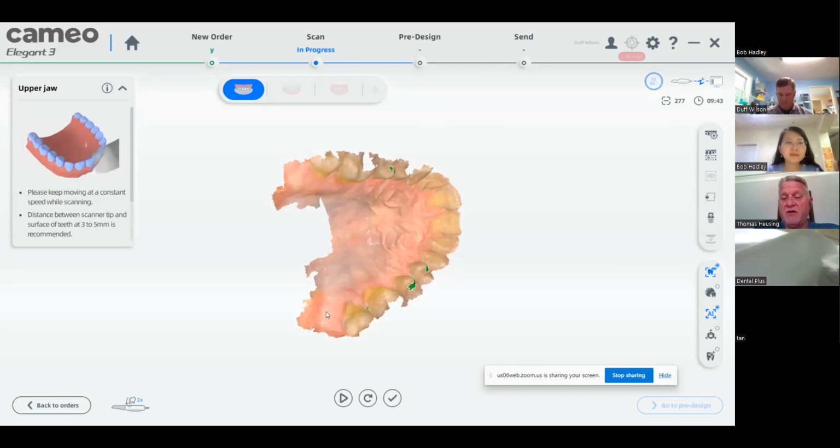We can certainly hire Duff through ADITE to go out and do this. However, most of the training would be done online. What we will do is train your lab on it, so you're experienced to train your doctors. And again, Duff can do this completely online, and he's had success with doing this with his doctors and other labs on the market today. So it's not unusual. It's just not feasible for us to send Duff out to do it.